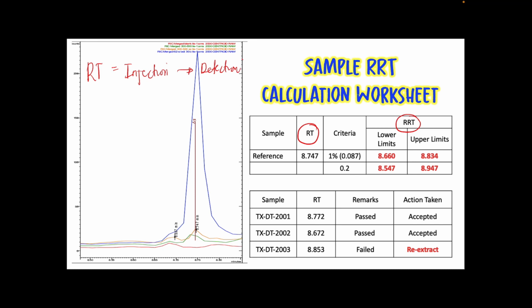Also, you have to take note that the retention time for a compound is not fixed because there are a lot of factors that can influence it, even if the same gas chromatography and columns are used. These factors can make it difficult to compare the retention times of the substances. Even if you use the same GC just a few days apart, there can be small differences in the retention time of a compound. And so the RRT was developed.